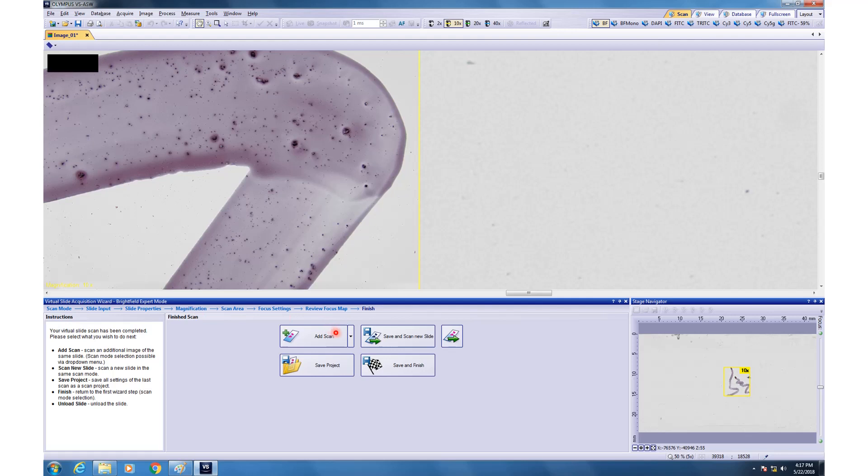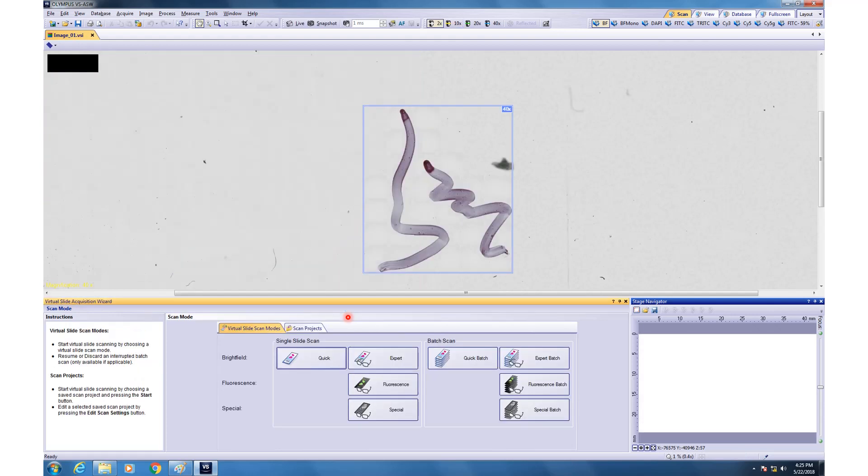If you are happy with this image, then you can scan a new slide or you can save finish and before you do that, I would recommend saving this project. What it will do, it will save all the settings that you have used so far as a file so that you can use it for batch scanning or you can reuse it for imaging another similar slide. Okay. So, with that, we come to the end of single imaging in the bright field. Now, we will try doing some batch mode. So, after save and finish, you can click on expert batch.